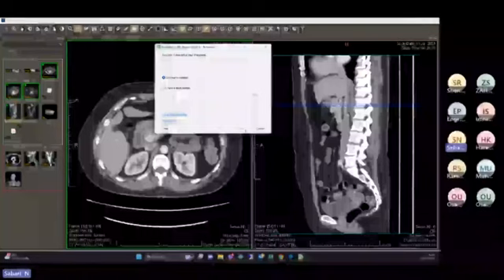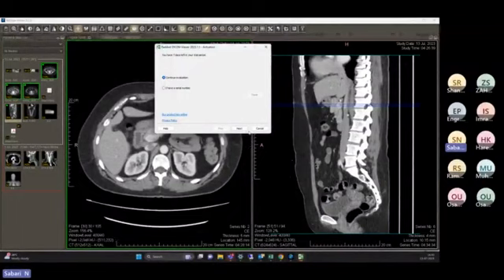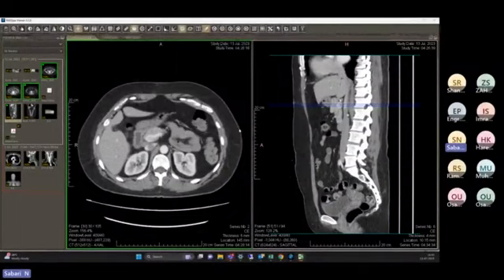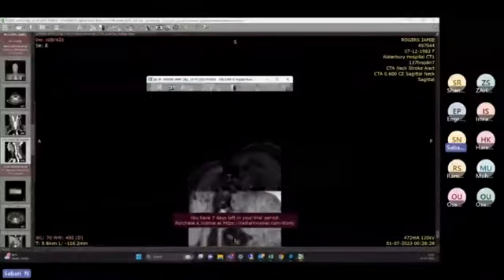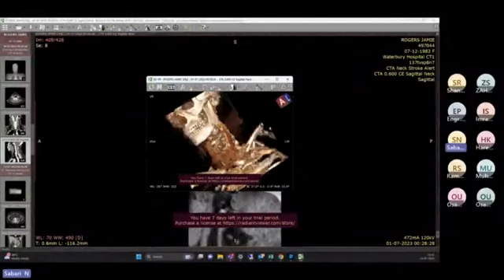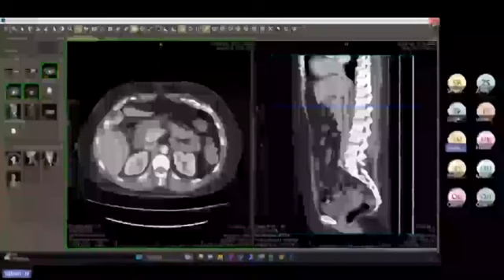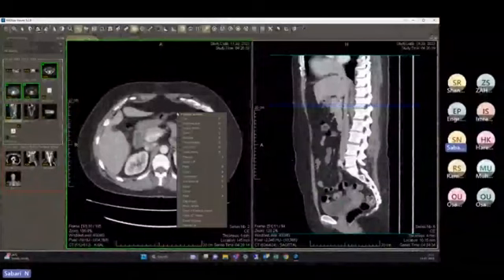That does not require any activations or anything else. Whether it is Radiant viewer, ClearCanvas, Meridian, or 3D Slicer, there are n number of DICOM software available. Anything you install, the images will open in it. As the radiologists are familiar with this, yes, you can start using this only. So there is no condition like my application will support only my software. You cannot use it like that.